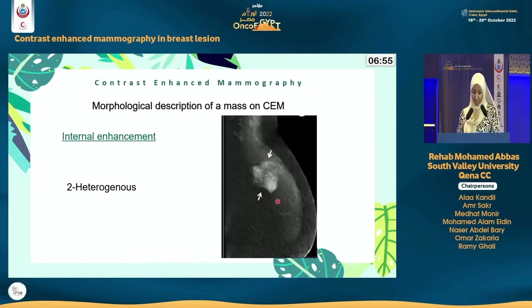الباترن التاني بتاعنا إن يكون في عندنا heterogeneous enhancement، إن هنلاقي فيه ليجن بيبقى في جزء منه واخد كونتراست وفي جزء تاني لا مش واخد، ده اللي بيبقى دارك في النص، ده غالبا بيبقى البريك داون بتاع الليجن، وده برضو من ضمن المالجنانت ليجنز، الإنهانسمنت بتاع المالجنانت ليجن.